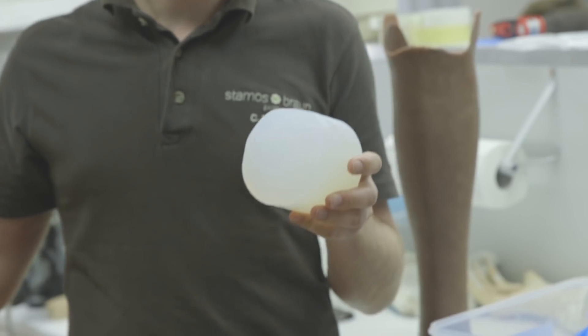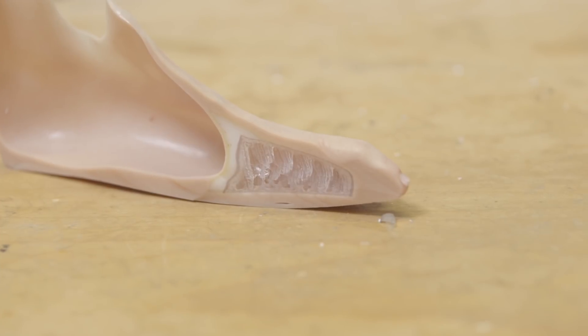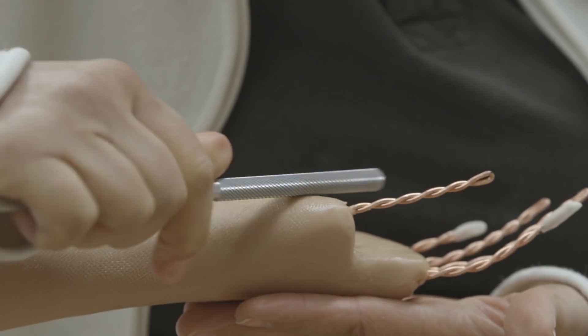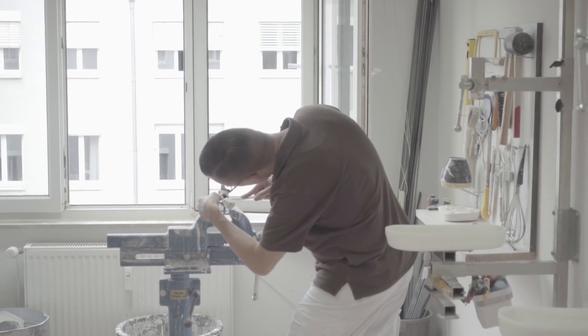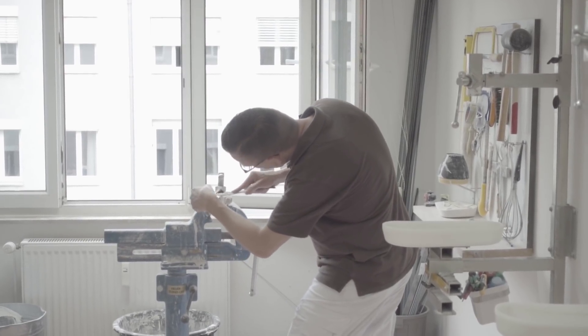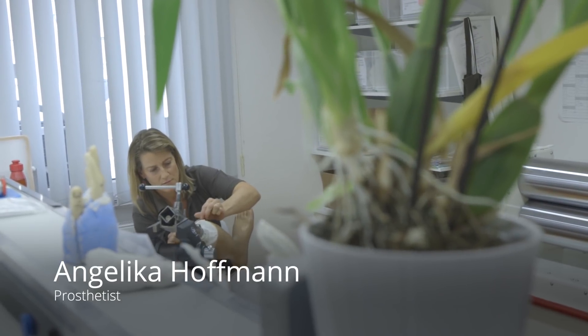To achieve this, we use specially approved silicone products to produce complex and customized 3D printed prostheses for hands, fingers and lower limbs. Each restoration feels like a small work of art whose individuality matches the natural shape and color of the wearer.